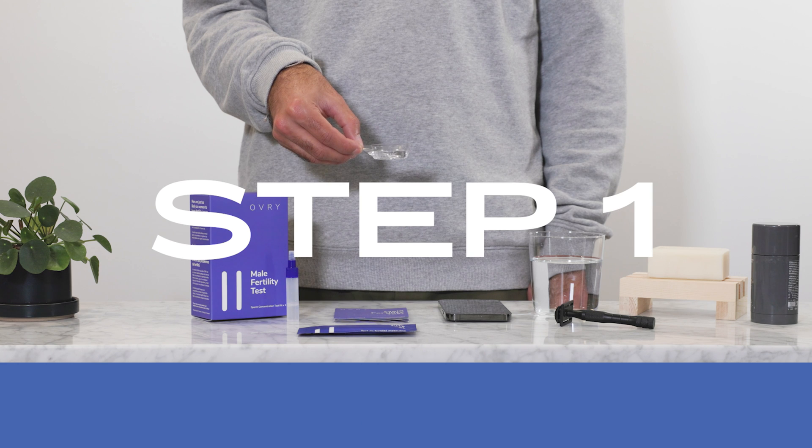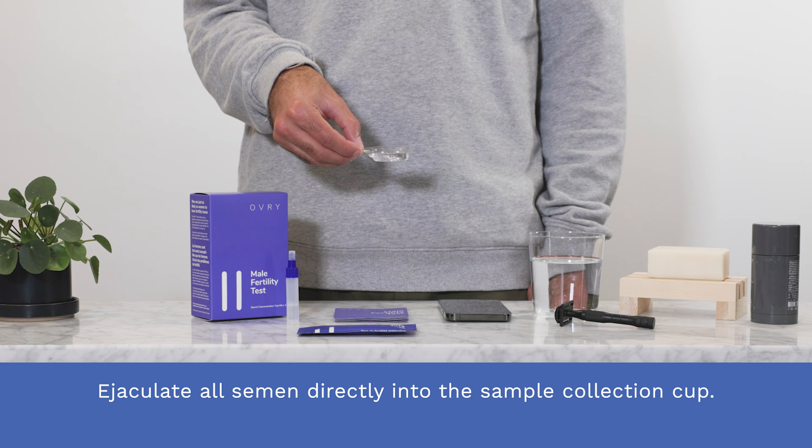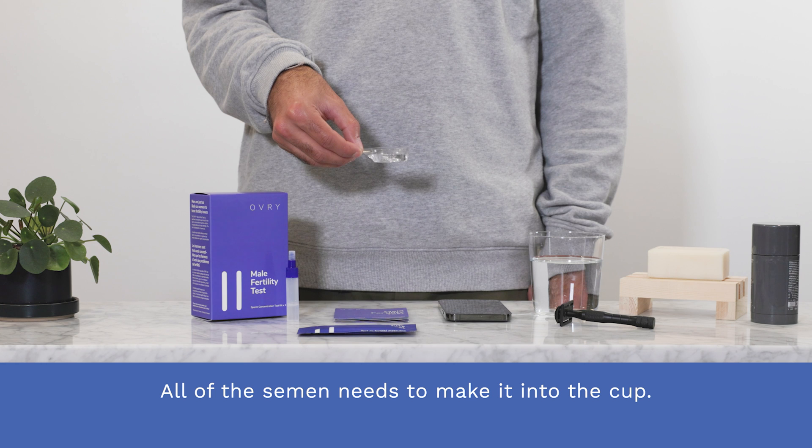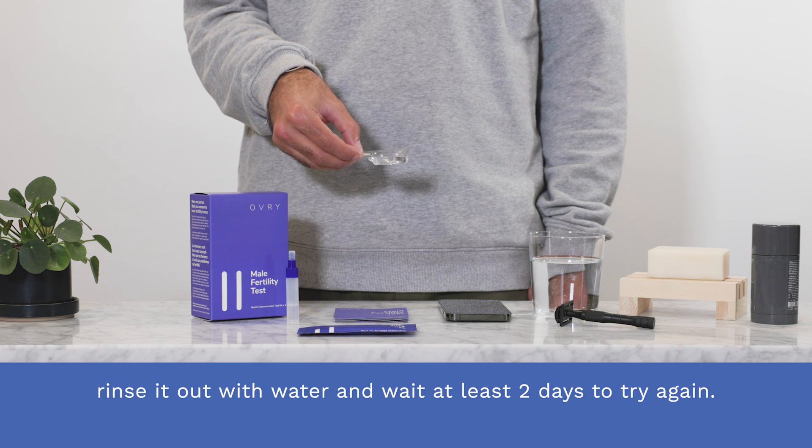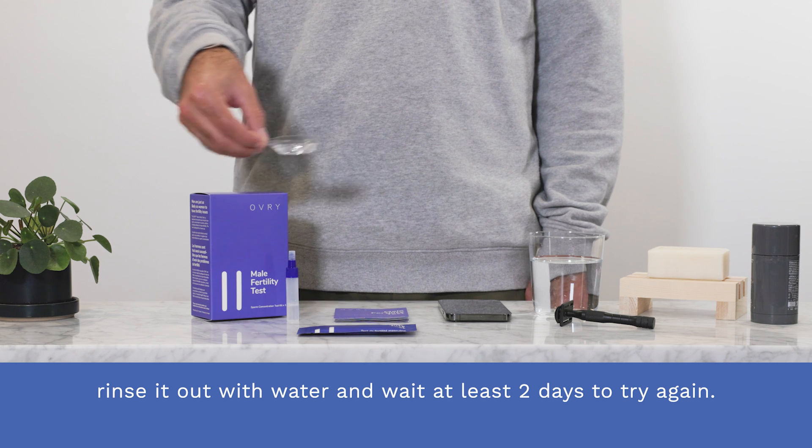Step one. Ejaculate all semen directly into the sample collection cup. All of the semen needs to make it into the cup. If some semen does not make it into the cup, rinse it out with water and wait at least two days to try again.